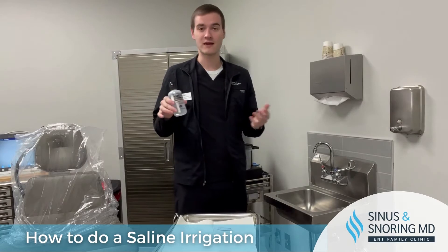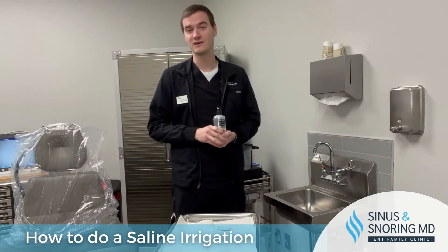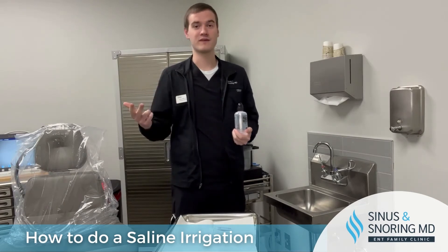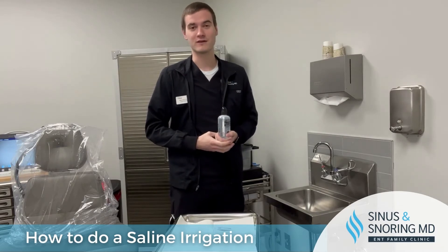Doing nasal irrigations is not only for post-operative use, but also for the average population. Doing a nasal irrigation is great for allergies, sinus infections, and preventing nosebleeds. The more moisture you use, the better it'll be for your nose.